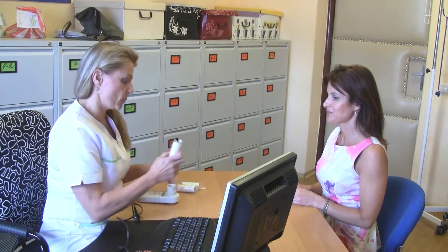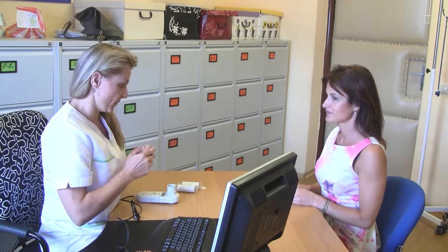A spirometer is used to measure lung functions. First, the doctor explains the procedure to the patient and illustrates how to blow into the device.